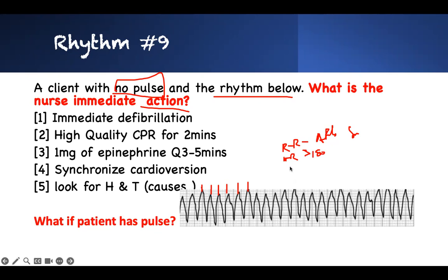I don't even see a P wave, so I'm not even going to attend. I see a QRS, but the shape is weird. It's like that. But it's uniform though. But the distance, look at it, from here to here is more than what? We're supposed to get three. It's greater than three boxes. So our QRS is greater than three boxes.